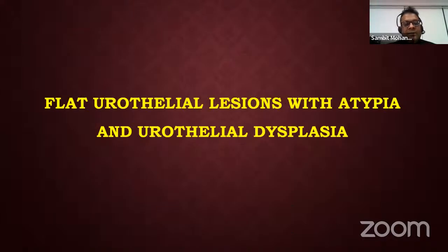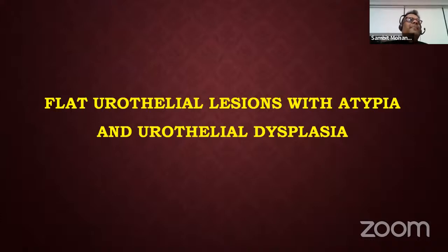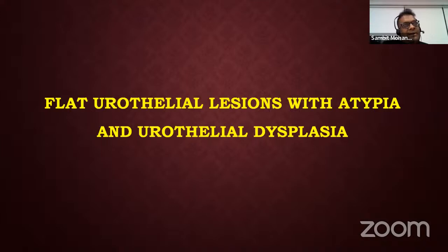Okay. So, flat lesions of the bladder. Sir, can we have a papillary urothelial neoplasm if the layering is less than, say, about 7 or 8, but what is the degree of atypia? Atypia is significant. Yes. If the atypia and branching are significant, then you don't care about the layering.